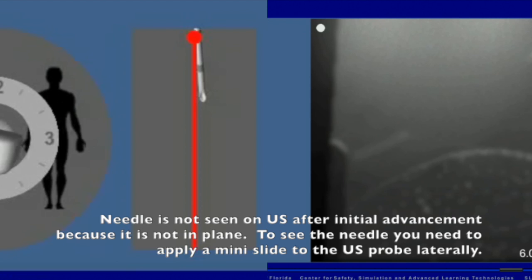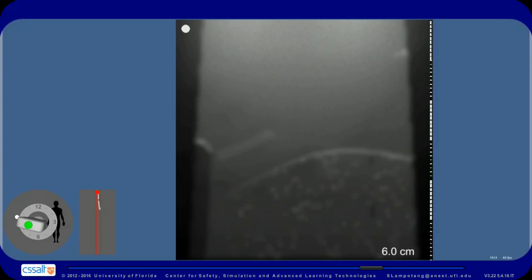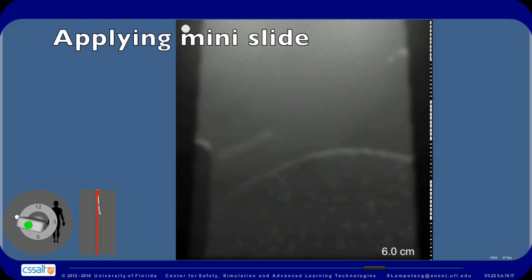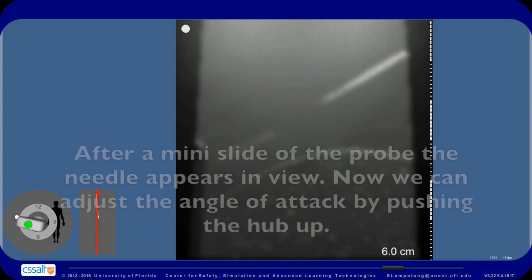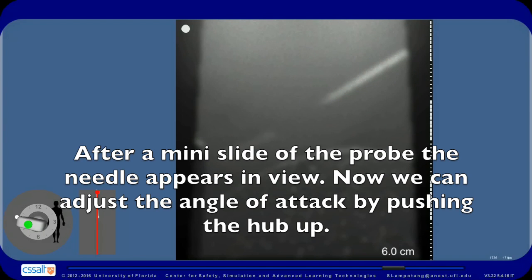If the needle is not seen on the ultrasound after initial advancement, it is because it is not in the plane. To see the needle, you need to apply a mini slide to the ultrasound probe laterally. After a mini slide of the probe, the needle appears in view.